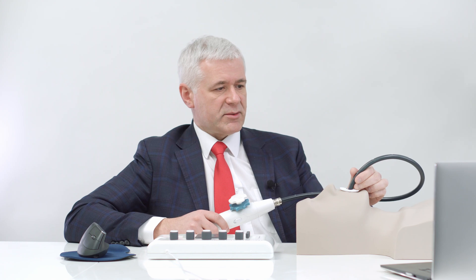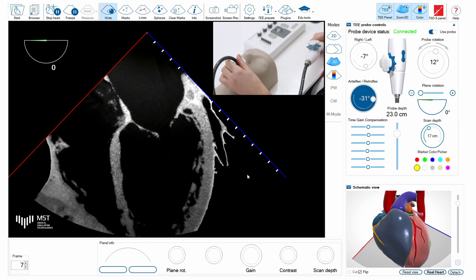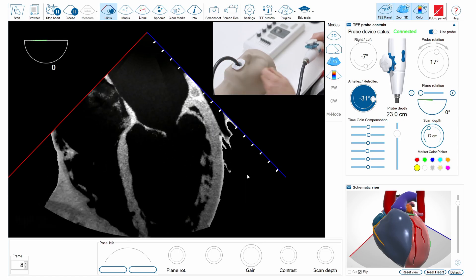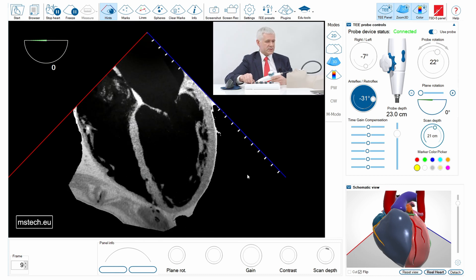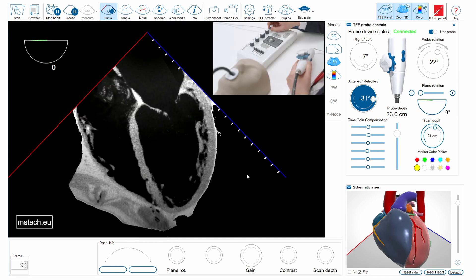Let's try to do some scanning of the mitral valve. Here you see this is the zero-degree four-chamber view. I can of course adjust the depth.